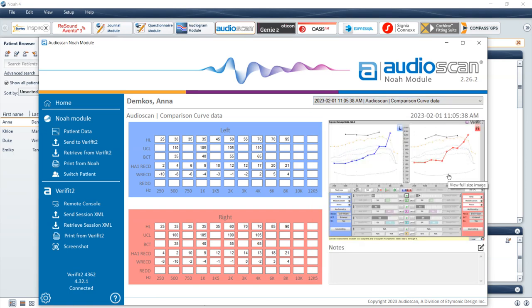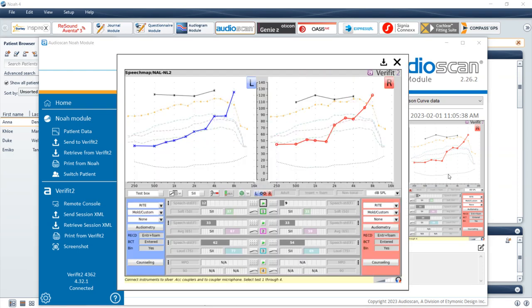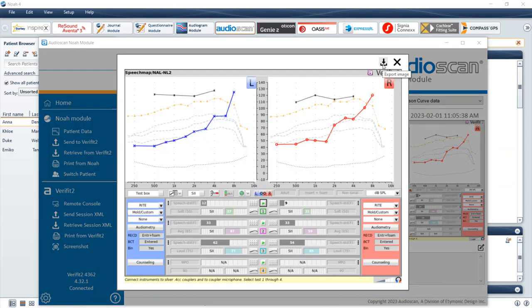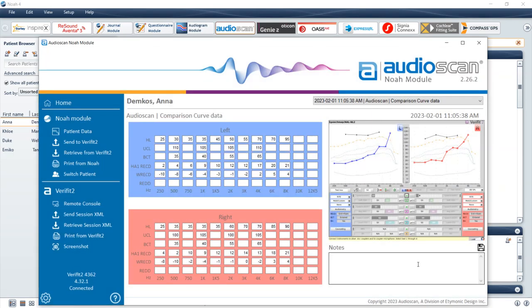To view the screenshot associated with saved test data, click the saved image. You can then select the Save button to export the screen as an image. You can add notes to the test result by typing in the notes field. Notes can be edited on the day that they were created by the NOAA user that originally saved the data; otherwise a new note may need to be created.